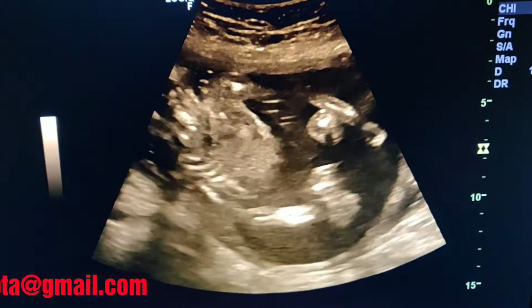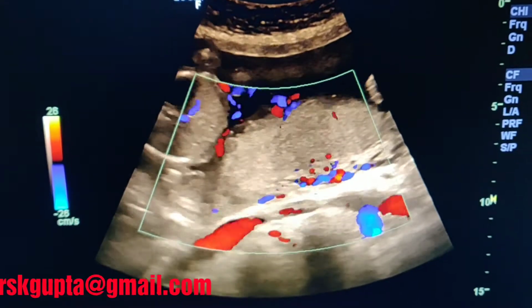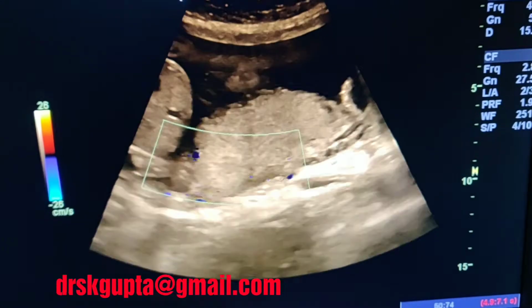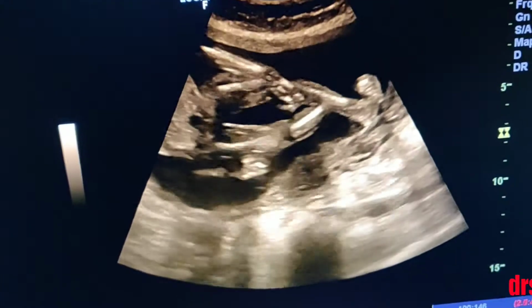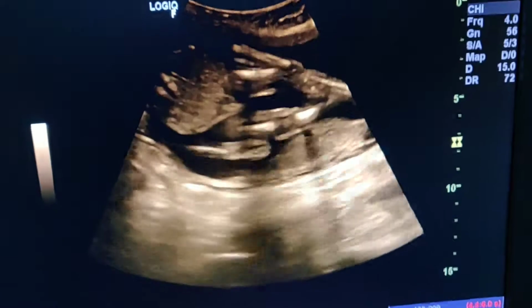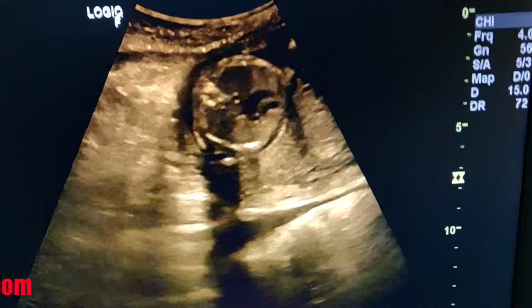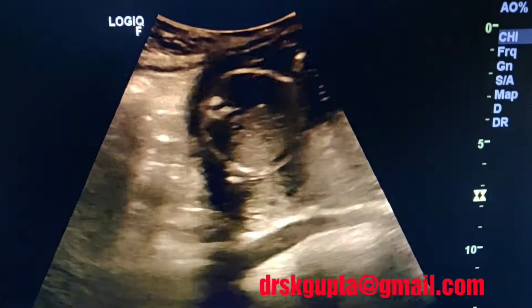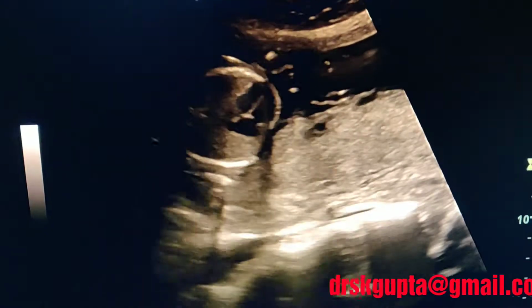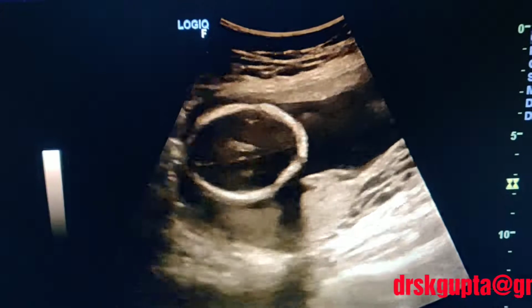You see both the arms of the baby. This is the attachment of the cord to the placenta, and both the ends should be defined: the placental end of the umbilical cord as well as the fetal end of the umbilical cord. Again, you see the feet of the baby. You see the heart. Heart should be seen in four-chamber view, and when you tilt the probe towards the cranium of the baby, then you can see the aortic view, you can see the three-vessel view, and then the pulmonary artery view.